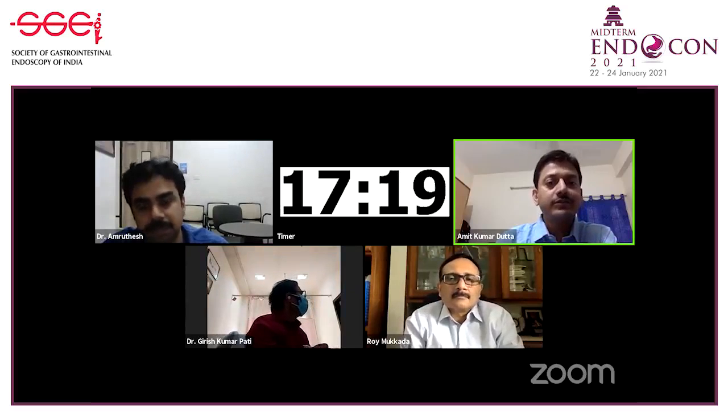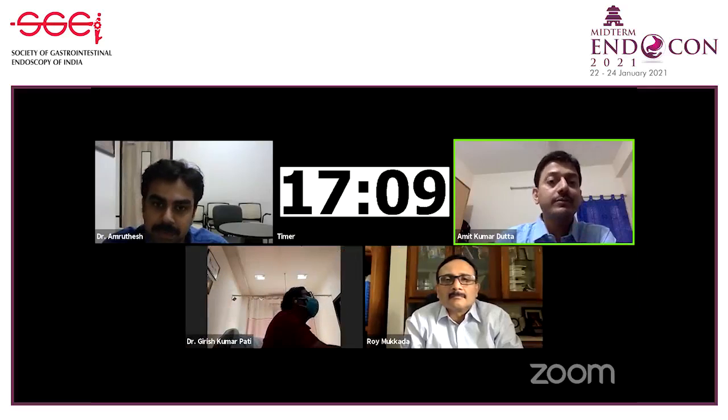And I think submucosal depth is the key information you need, because if you don't get submucosal information, and it turns out to have some carcinoma in any part of the lesion, then you don't know whether your margins are good. So the submucosal depth is a very important aspect the pathologist should give you. But you should mount the specimen properly and send it to them, and you should ask them for that information, which I think mostly they will give. That's what I would say.